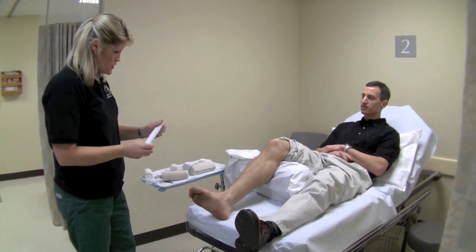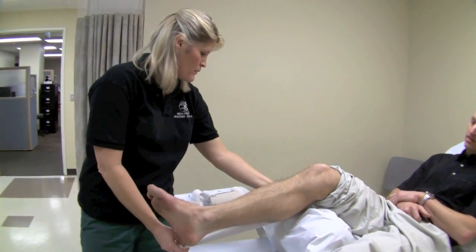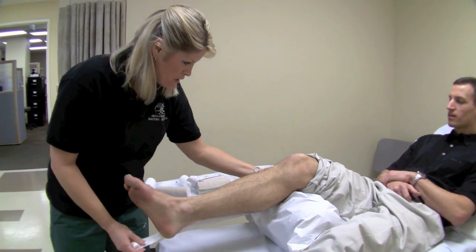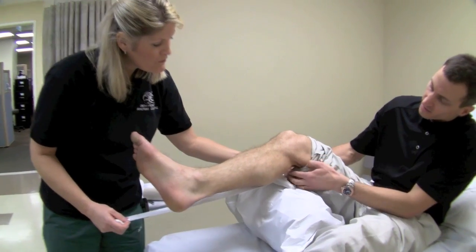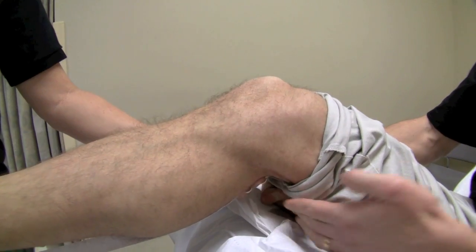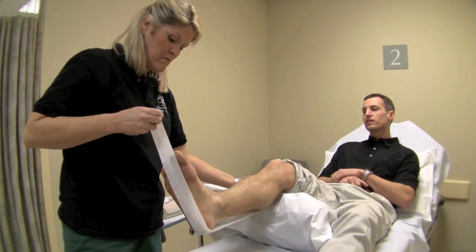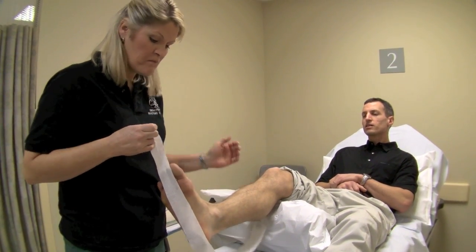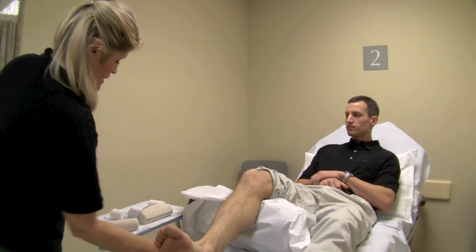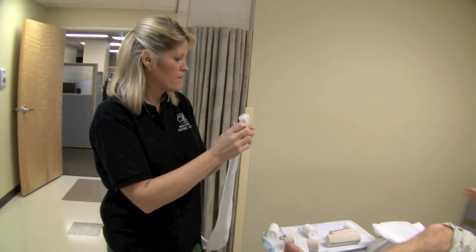For measuring out the fiberglass, I'll stick this under your leg. I want to go two finger widths below the back of your knee — two finger widths distal to the popliteal fossa — that's where we're starting. Then I'll measure out past your toes, about four inches past the tip of the toe. That's going to be the length for my fiberglass — you could use a ruler or whatever.